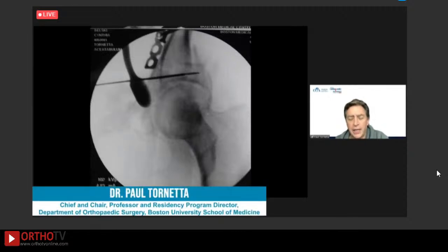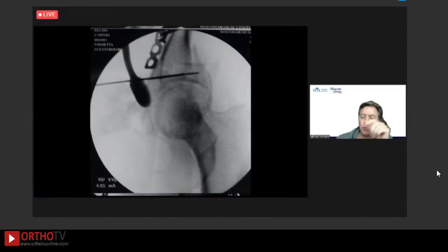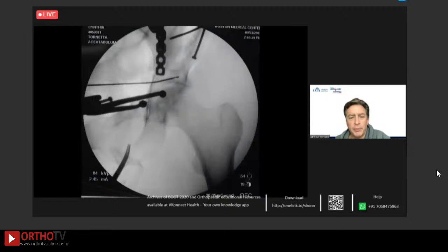And I agree completely with Hassan. These posterior walls associated with both columns are vertical, and you can usually lag them from the front or even slide a plate down from the back and then put a perc screw across, but you don't need to do a Kocher to get to it. So it started to look a little better at this point. You can see a lot of pushing and pulling. Everything that you see that looks like a pushing thing is just me sweating more and more throughout this. So then we finally got that looking okay. I got a K-wire in it and held it.